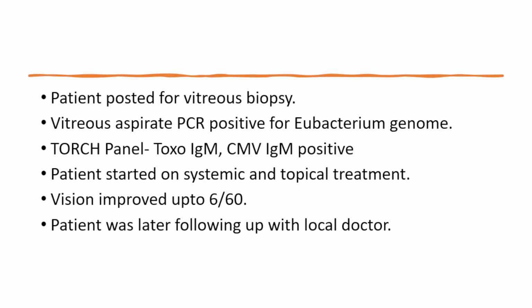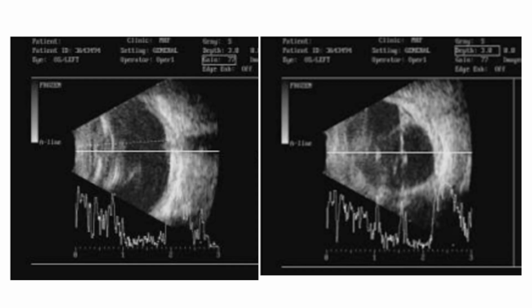Devika, is it a posterior granuloma or a peripheral granuloma? Peripheral granuloma inferior to the disc. But I think in the image you mentioned the granuloma is over the disc. You told everything is going and attaching to the ONH in the second image, the ultrasound image. If you see in the first scan, the ONH shadow just shows some membrane kind of thing. So the second scan is the inferior scan, right? Yes, ma'am. So it is a peripheral granuloma with some membranes going from the optic disc.